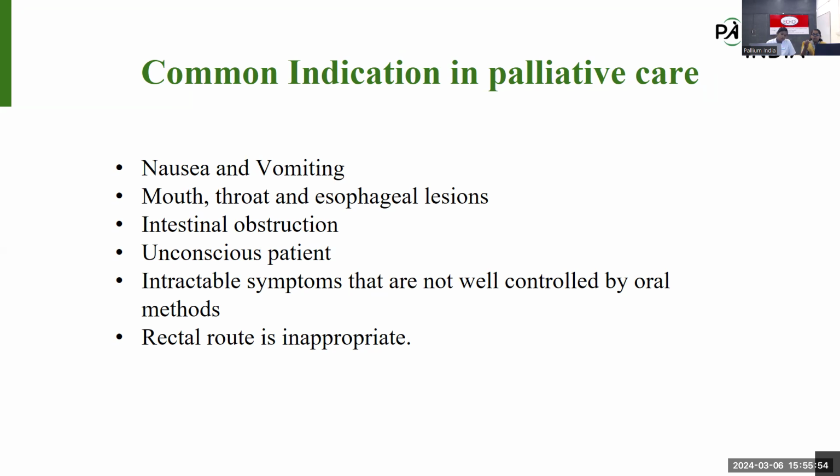So in such situations, you have to teach the caregivers, build their confidence, and let them give the injection. They can push at least 1 ml, 2 ml. In between you can tell them, call us if you need any help. You can make a video call and instruct them how to give. So this kind of education is needed, especially in end of life care.